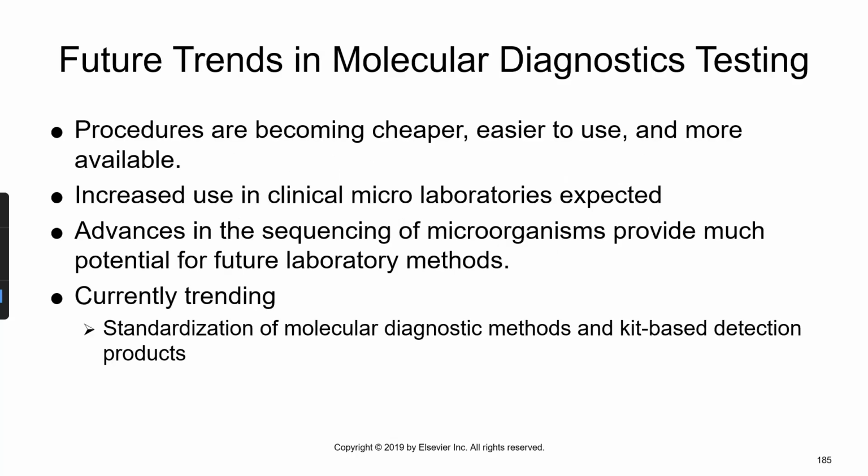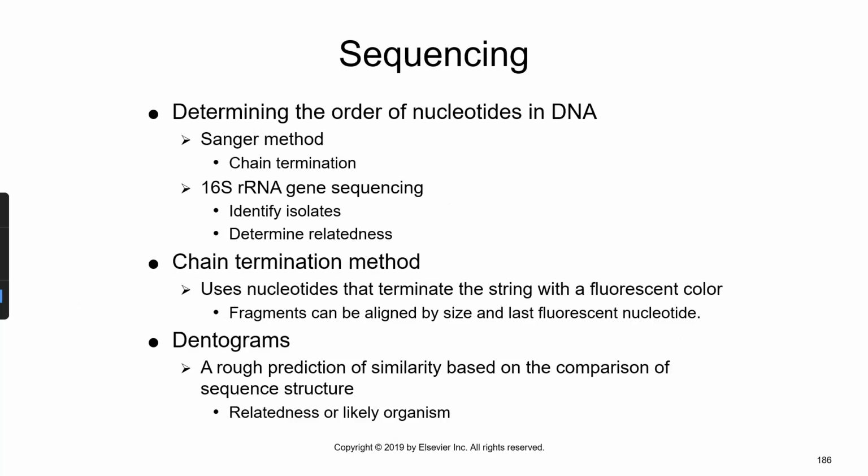Future trends in molecular diagnostics: procedures are becoming cheaper, easier to use, and more available. Increased use in clinical microlabs is expected. Advances in the sequencing of microorganisms provide much potential for future laboratory methods. Currently trending is standardization of molecular diagnostic methods and kit-based detection products.